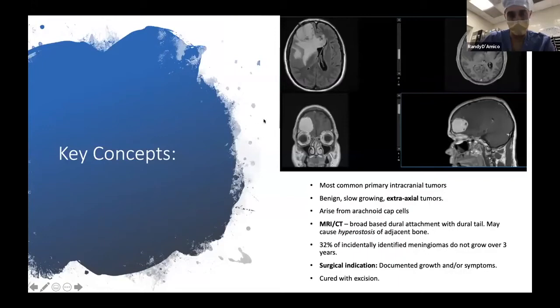So yeah, symptoms wise, again, it depends on where it's located for the most part. And we'll talk about that. And then yeah, risk of recurrence without shaving the bone. That's right. Typically when you take the bone off like that, you've devascularized it. And so that bone will fuse ultimately and it could grow back, but for the most part it dies. We will shave it though, just like that. So on the scan here, this was all tumor. All the white stuff right here was tumor. And this person is cured and doing fine.